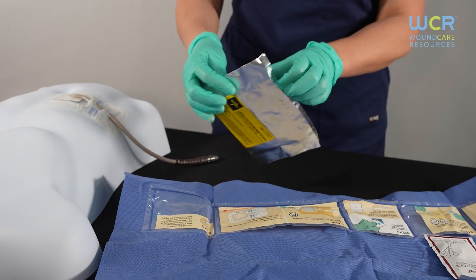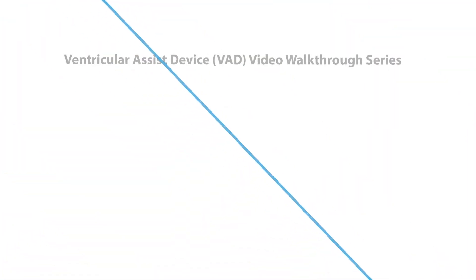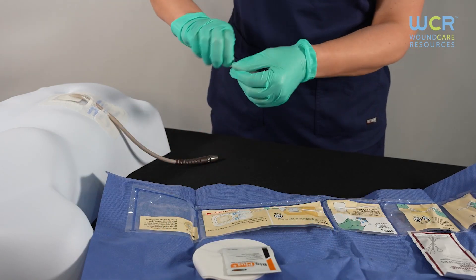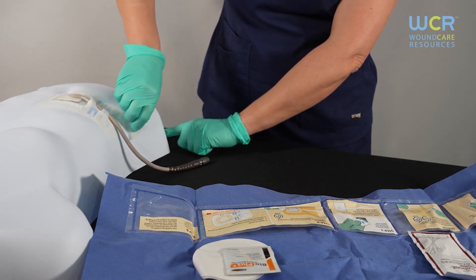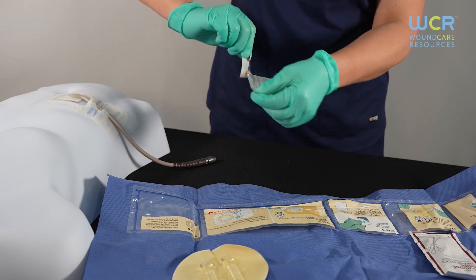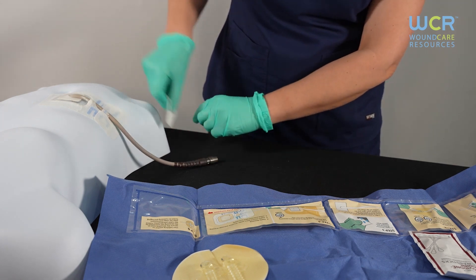Step 5 includes the Cath Grip Low Profile Securement Anchor. The easiest way to remember this application is A, B, C — 15, 15, 15. Start with Step A, which is the alcohol prep pad: cleanse the area and allow the alcohol to dry completely. Move to Step B, the BioPlus skin barrier: apply the skin barrier to the area just cleaned with alcohol and allow it to dry for 15 seconds. Wait the entire 15 seconds for it to dry completely.